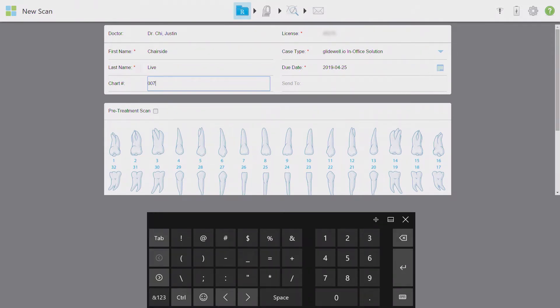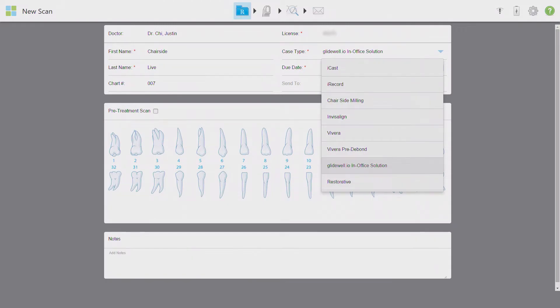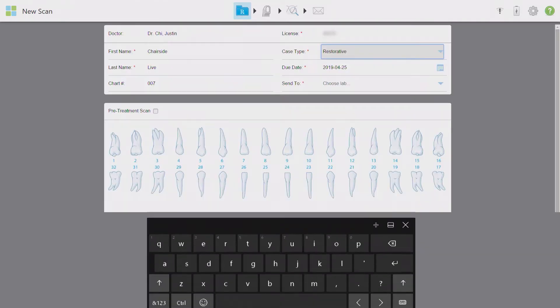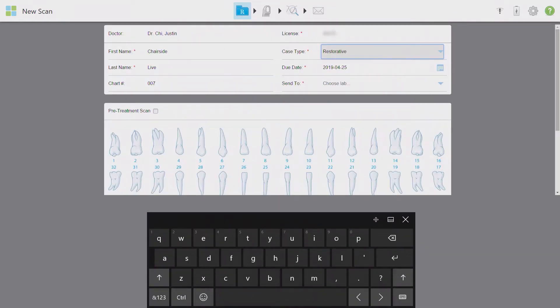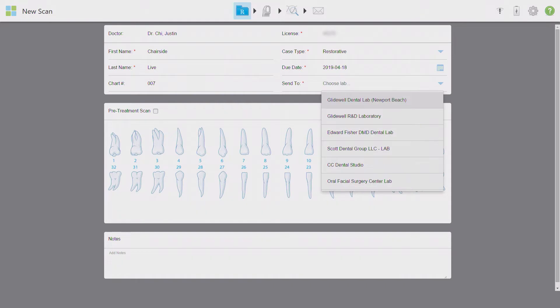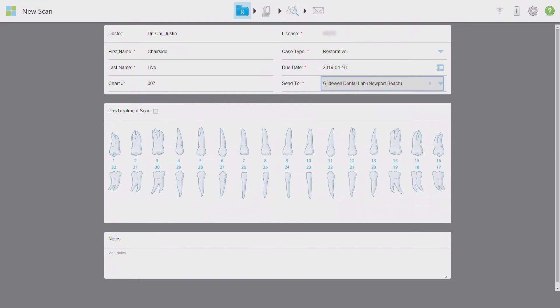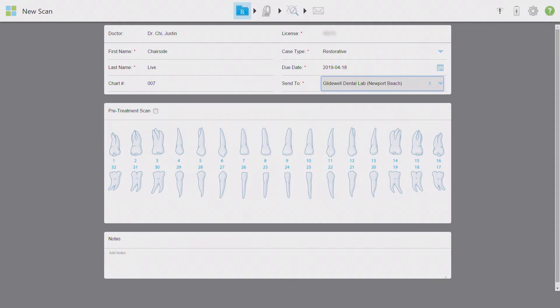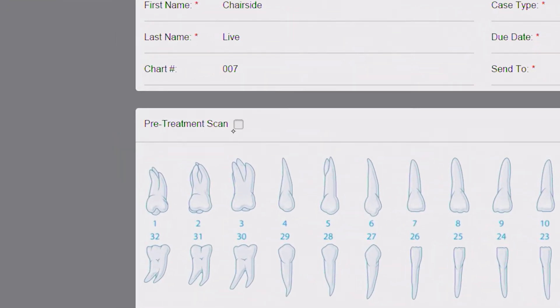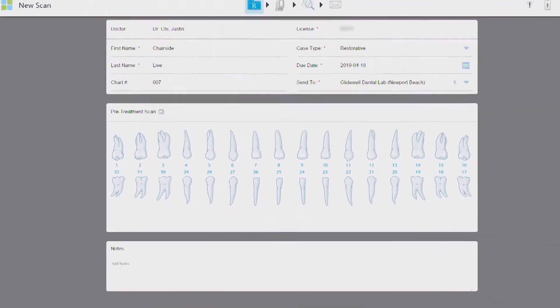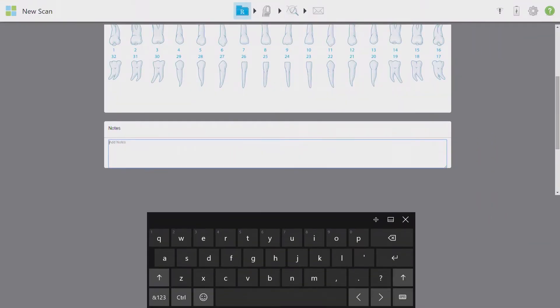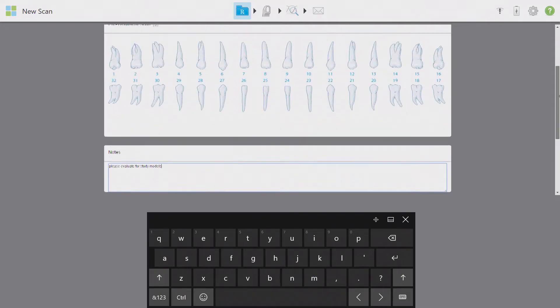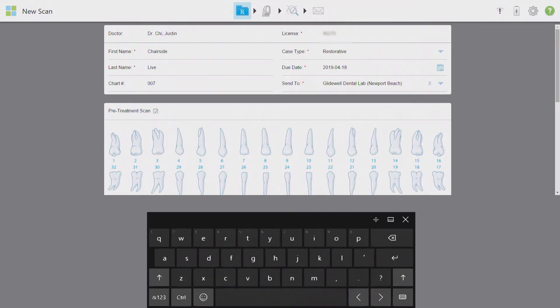Since we are scanning a patient pre-treatment today, I'm changing the case type to restorative. This option will allow you to send this case to the lab for a variety of pre-treatment needs that I mentioned earlier. Due dates are set at a standard two-week turnaround time unless you change that manually for rush cases. Then I'm going to designate this scan to be sent to Gladwell Dental Lab as the recipient. Now the most important step here is to click on the pre-treatment scan box rather than to leave that area blank. This is telling the iTero that no teeth are being selected for treatment and no additional information needs to be entered on the tooth-by-tooth basis. Any specific instruction at this point can be entered in the notes section below the chart. I want you to be as detailed as you'd like to be while entering these notes. There is no such thing as adding too much collateral info while explaining treatment requests.